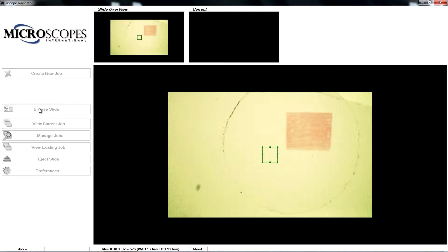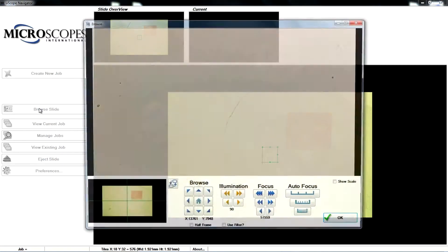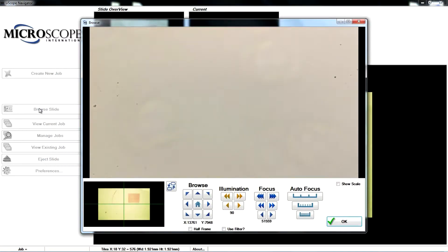The browse window opens and displays an overview image and an objective image.